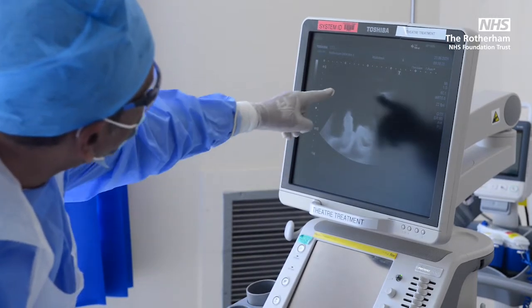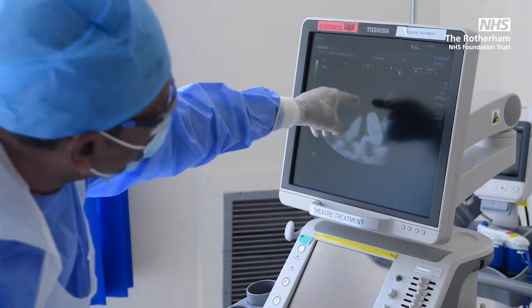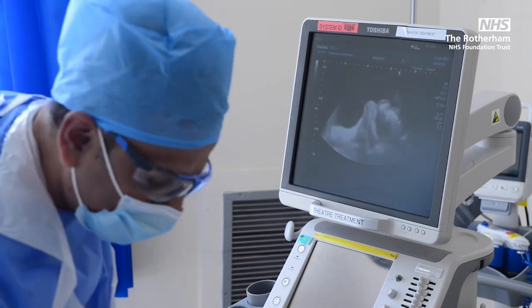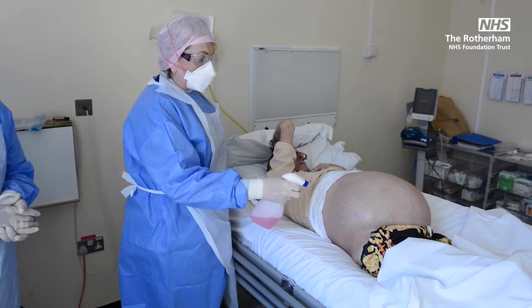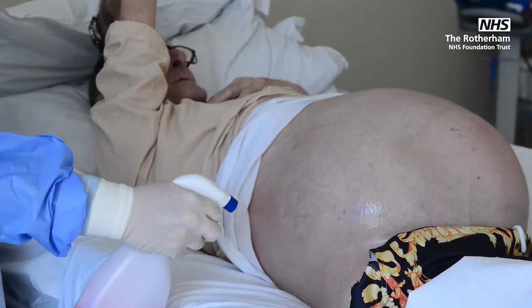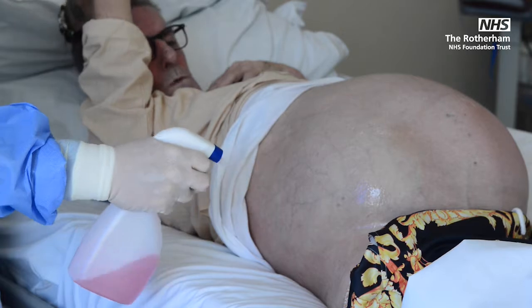So I can see plenty of fluid on here, and there are some bowel loops that I can see. The black area that you're seeing on the scan is where the fluid is. So I'm going to mark that area. We're going to spray this area with some chlorhexidine, making sure that it is all sterile before we start the procedure. Also, make sure that the area is completely dry.